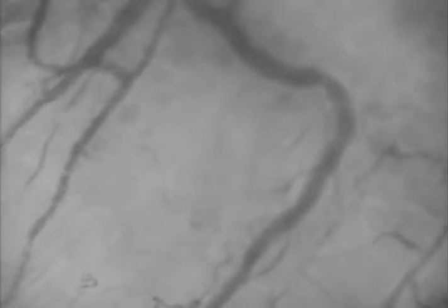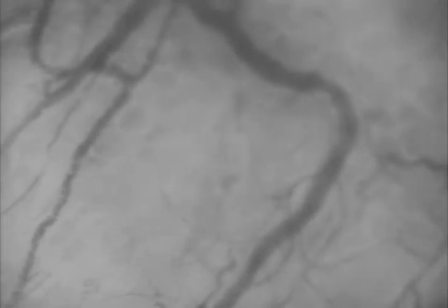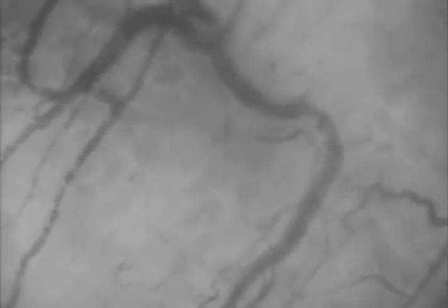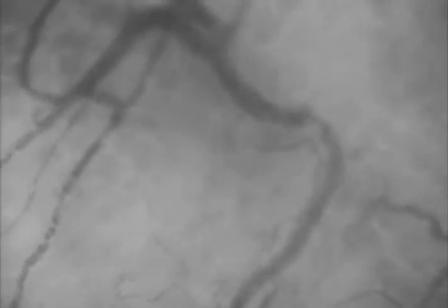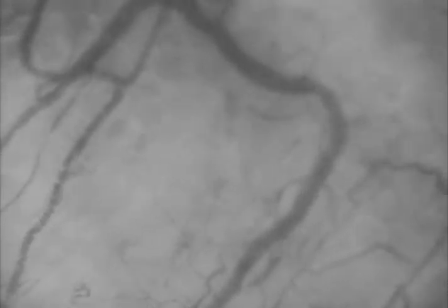Here's another example looped a few times over. The larger vessels should always be flowing. Here's the clip again in slow motion. Here's the clip again at normal speed. We'll play it through one more time.